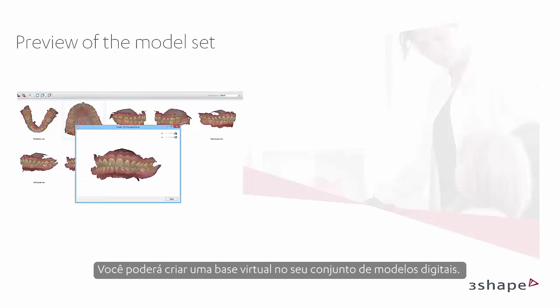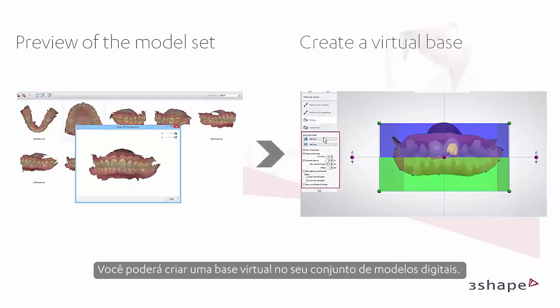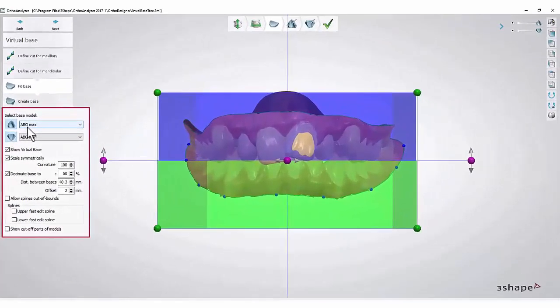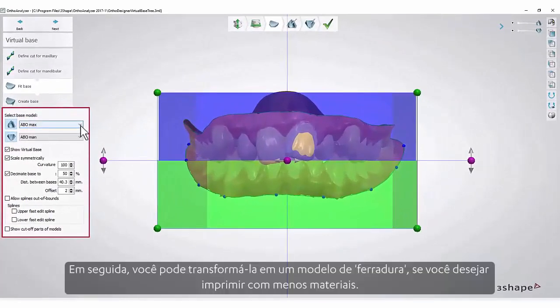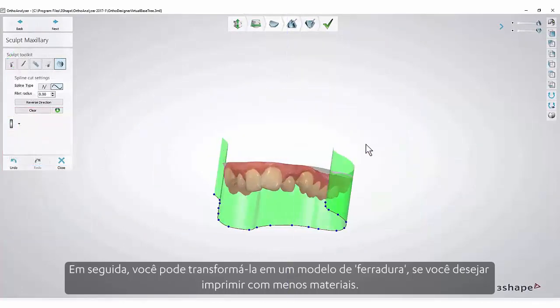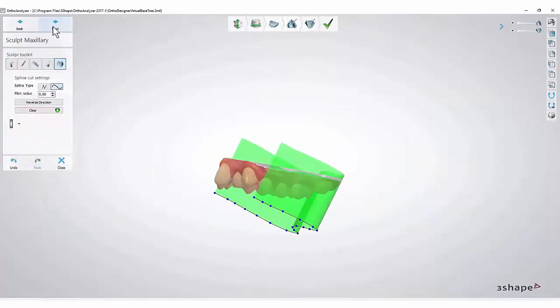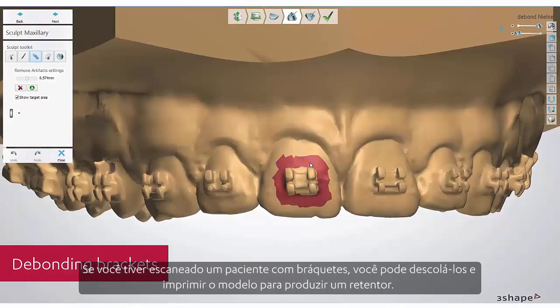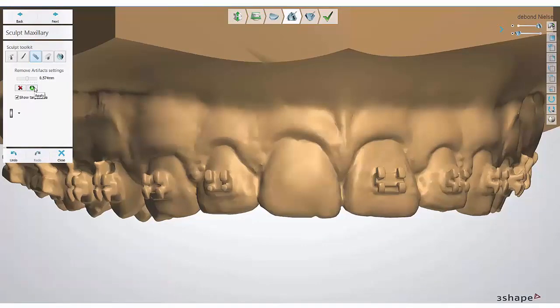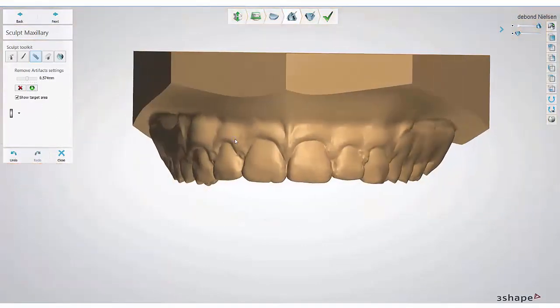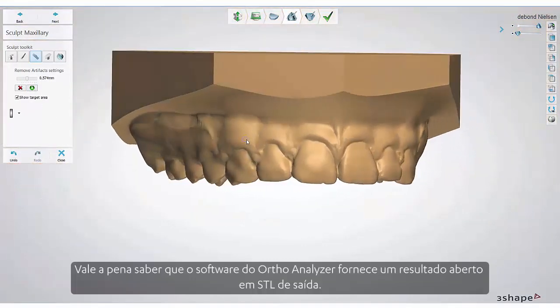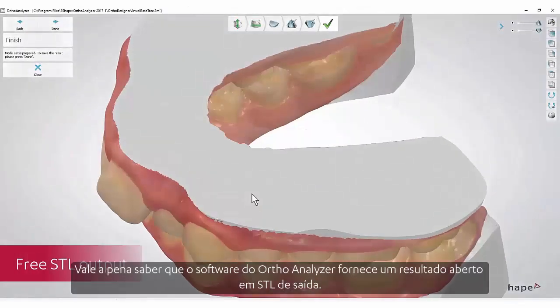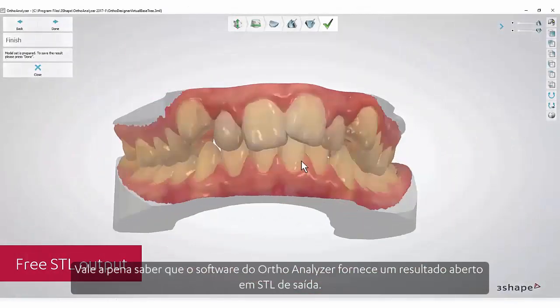You will be able to create a virtual base on your digital model set. You can turn it into a horseshoe model if you wish to print with less material. If you have scanned a patient with brackets, you can de-bond and print out the model to produce a retainer. It is worth knowing that OrthoAnalyser software provides you with a free STL output.